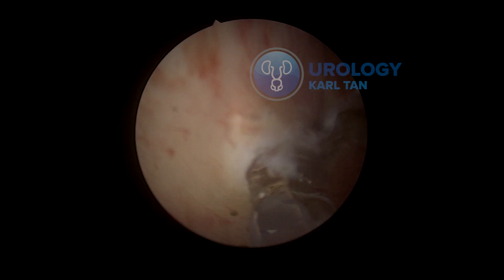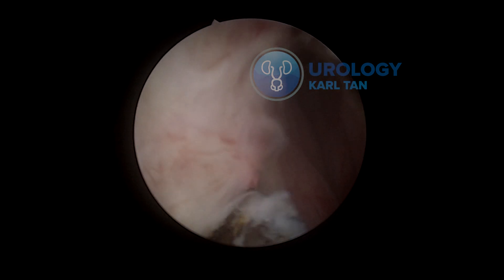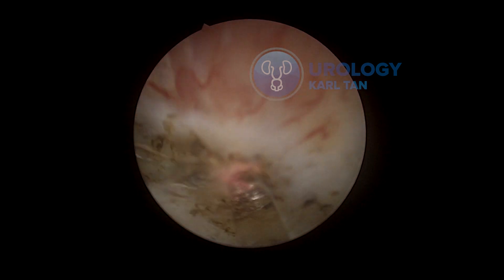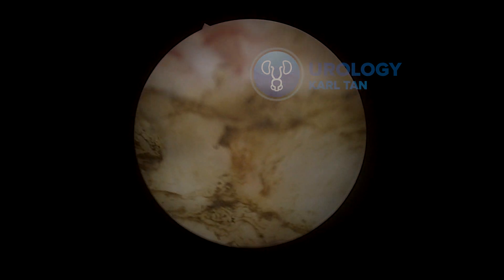I release the mucosa of the urethra so that I can preserve the mucosa, as explained by Professor Sancha in his early apical release, just to prevent incontinence or to have continence recover faster.